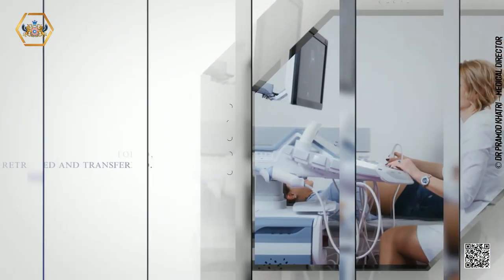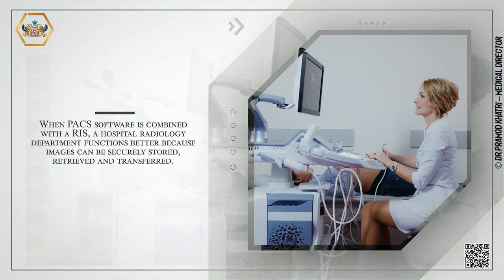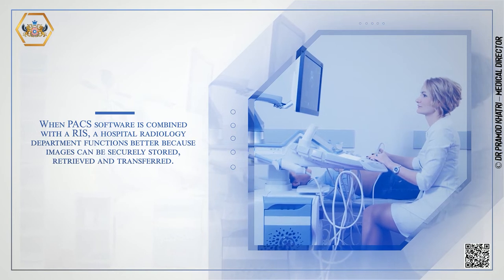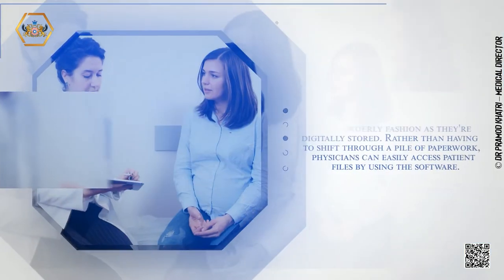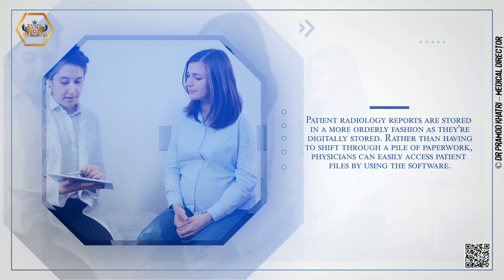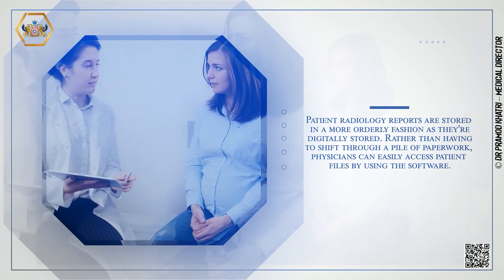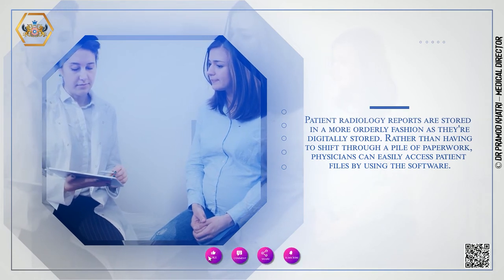When PACS software is combined with RIS, a hospital radiology department functions better because images can be securely stored, retrieved, and transferred. Patient radiology reports are stored in a more orderly fashion as they are digitally stored. Rather than having to shift through a pile of paperwork, physicians can easily access patient files by using the software.